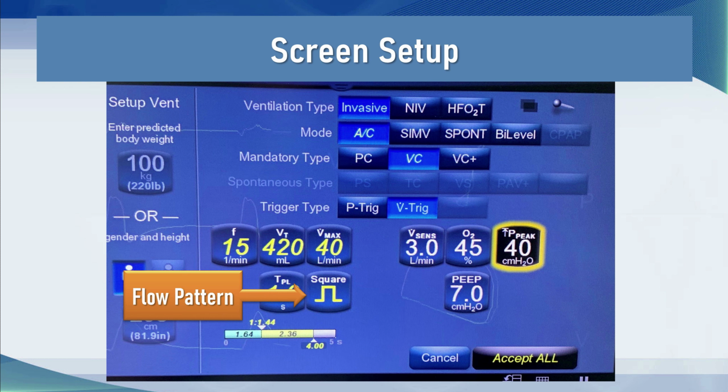And finally, one thing that's really important if you're setting a patient up on volume controlled ventilation is to be really careful about the airway pressures. Why would you do this? Well, first of all, you can do something really stupid like put a 4-year-old child on a ventilator and give them a 500 ml tidal volume, which is massively excessive and could destroy the patient's lungs. So by having a pressure pop-off level, it means that with this entirely inappropriate tidal volume, once an airway pressure is hit, for example, here at 40, the pressure is just released from the machine, and hopefully the person who set it up will get the message that they've made a terrible error.